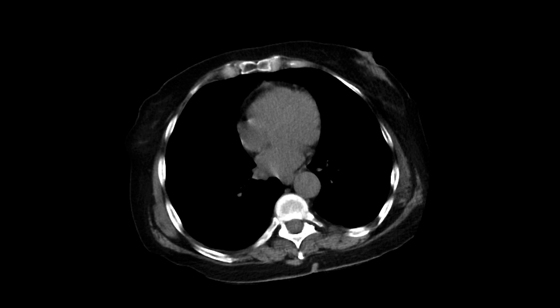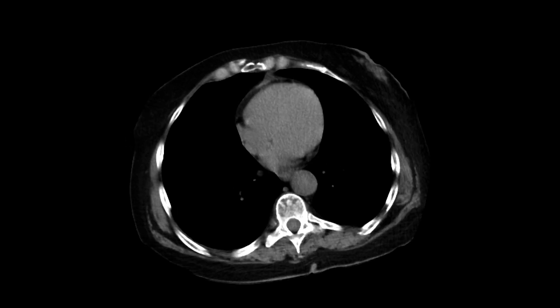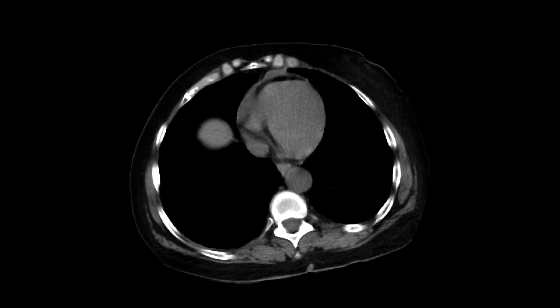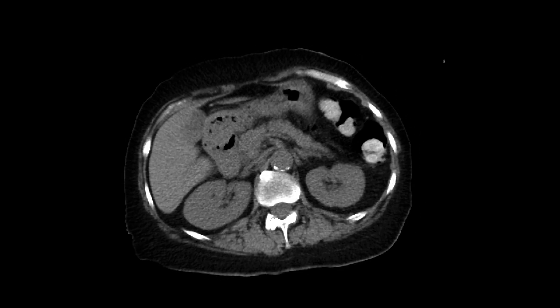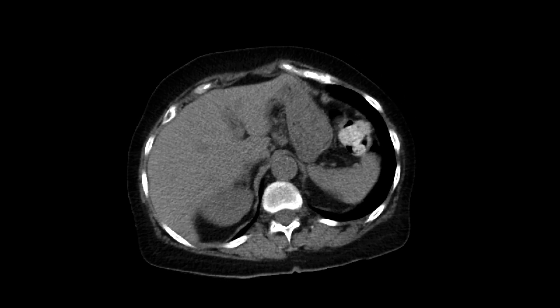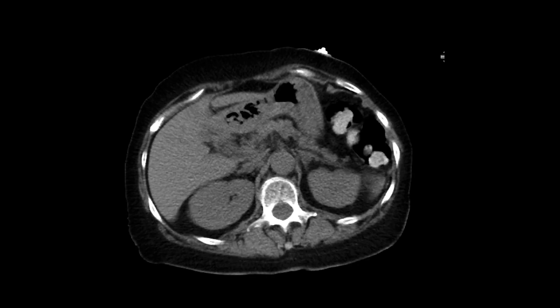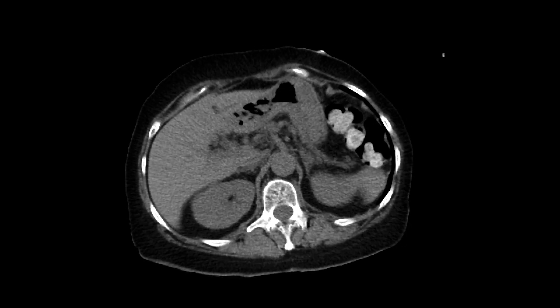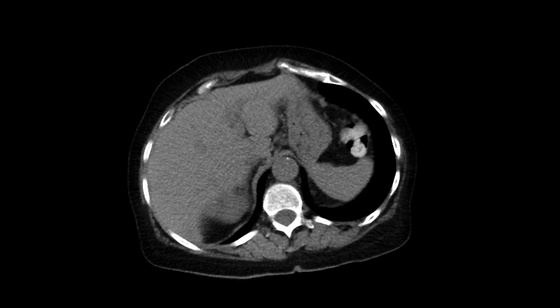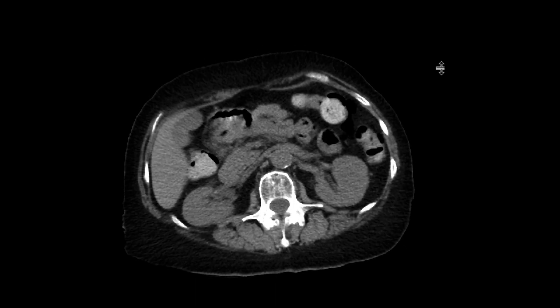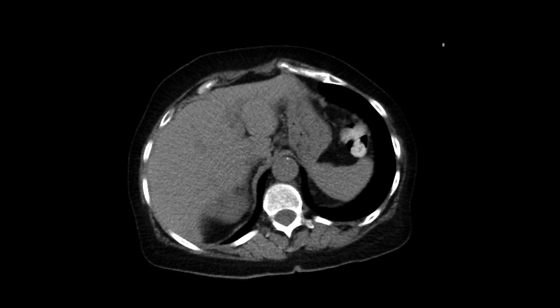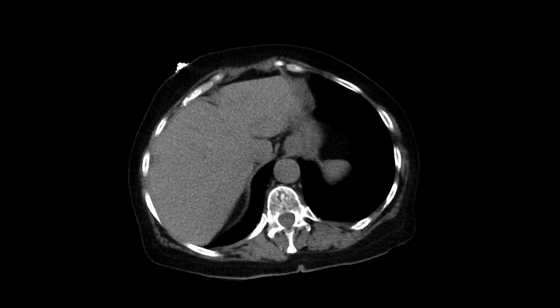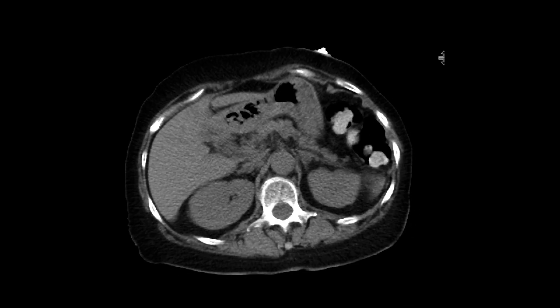This is a patient who comes in with abdominal pain and got a CT scan without intravenous contrast. As we scroll down, we look at the upper abdominal organs. They look pretty okay — the spleen, kidneys, adrenal glands, pancreas, gallbladder, liver. Nothing acute going on here, nothing of concern. There's a small hiatal hernia.